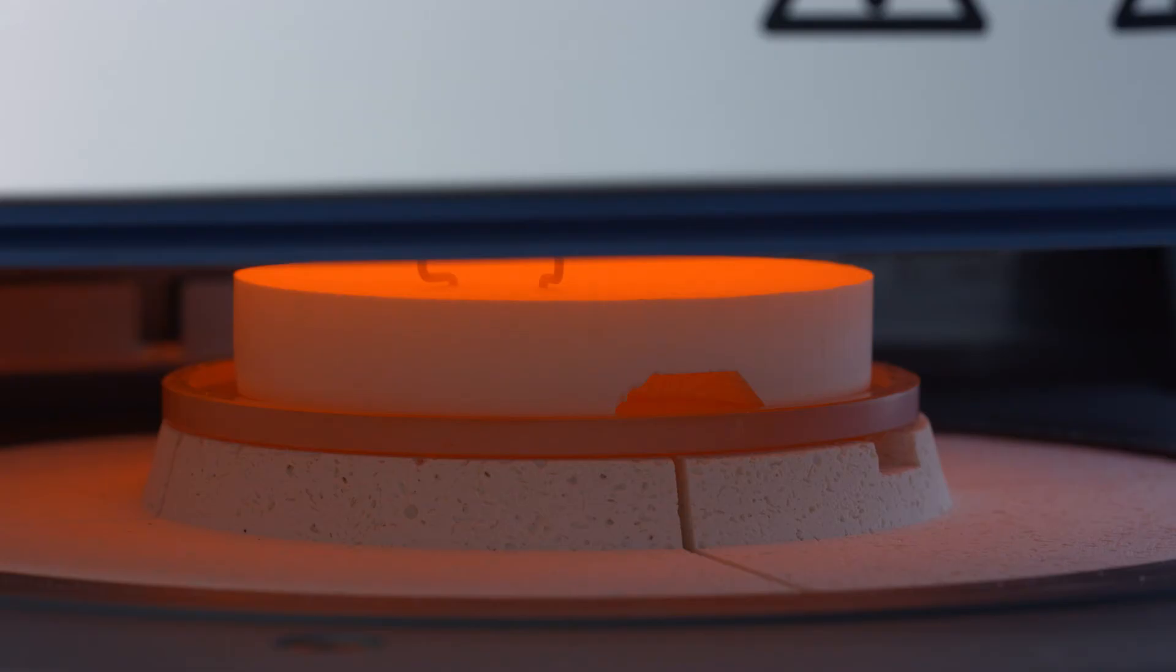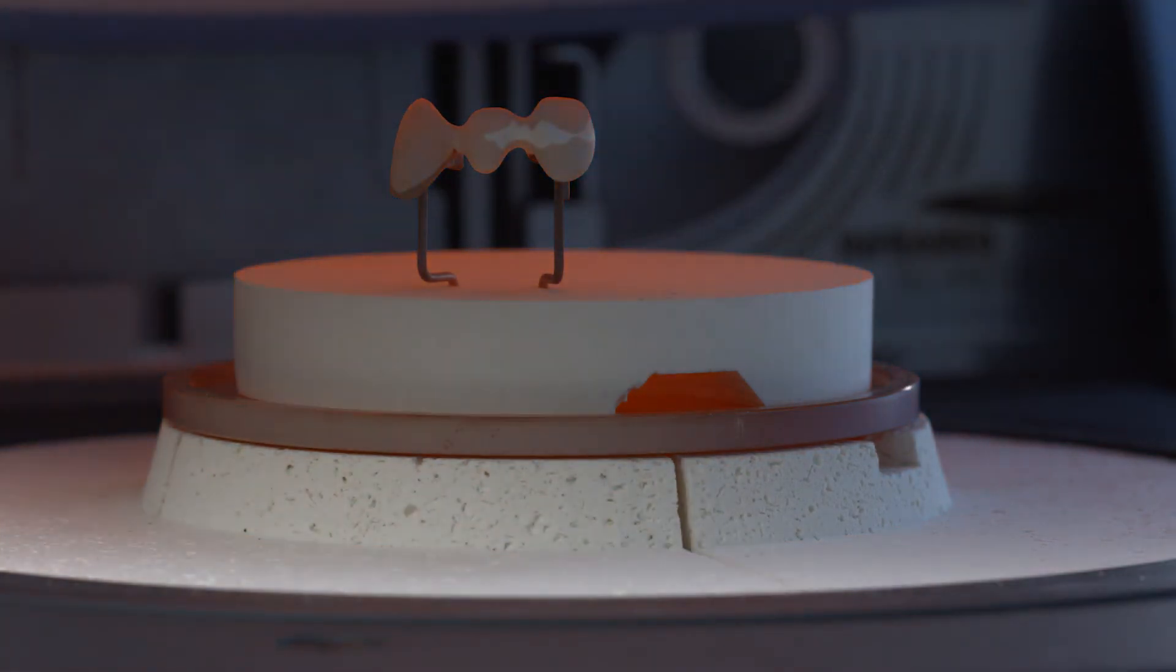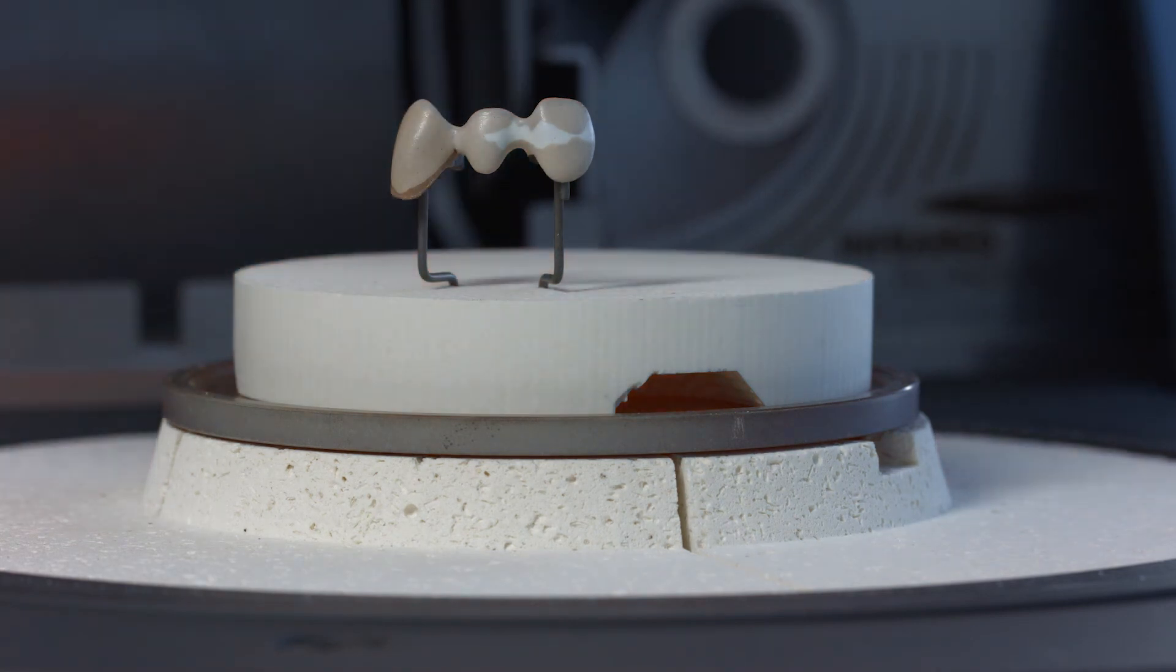The opaquer should show a full-coverage, silky-matte surface after firing. Check to make sure that the veneering surfaces of the alloy framework are completely covered with opaquer.